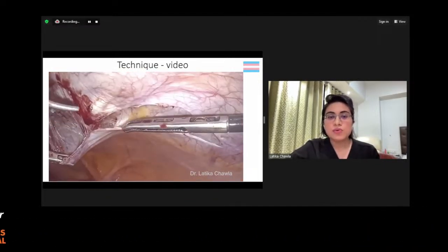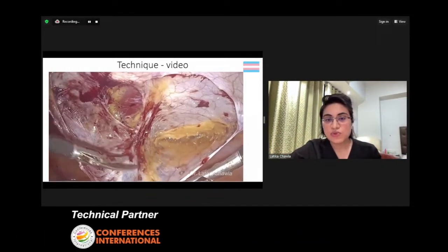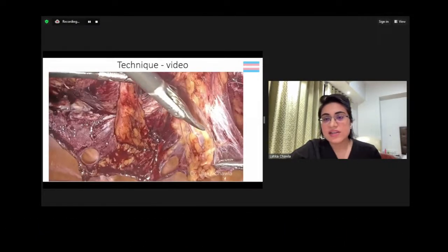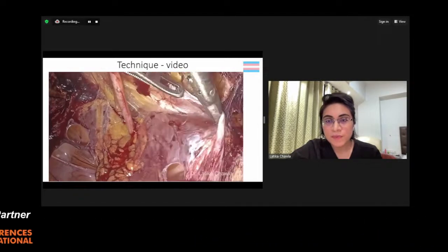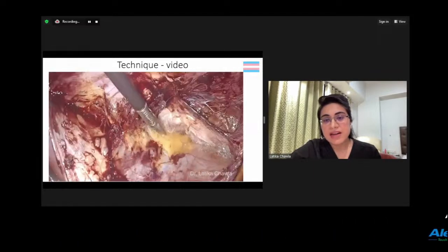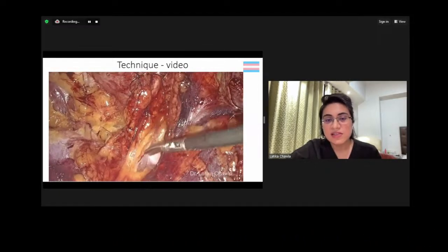Because we are going to turn this peritoneal flap and push it inside the neovagina in the steps to follow. The second most important dissection here is the lateral dissection, which is at the triangle of doom. Now, as you see here, I am dissecting in the area of the triangle of doom, which basically is lined by the internal spermatic vessels and the vas deferens. And we want to make sure that we stay away from the iliac vessels.